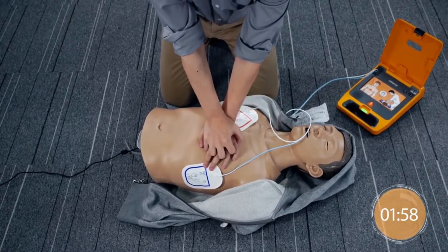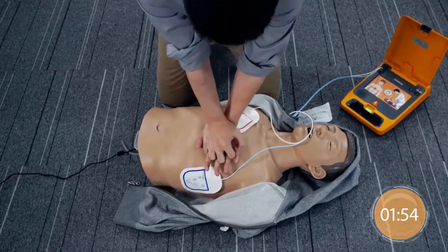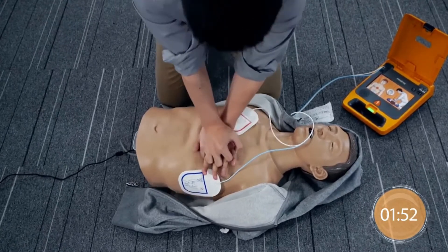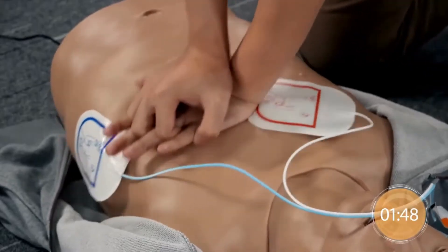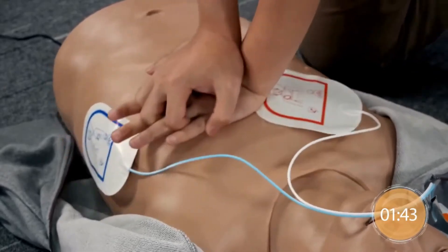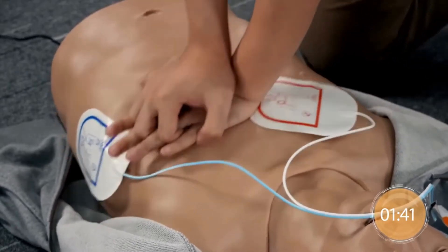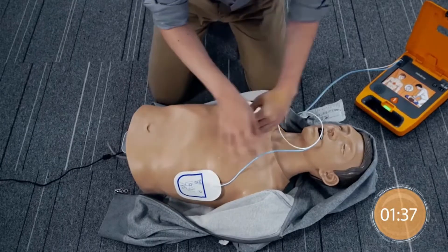Start CPR immediately. Follow the metronome to give 30 compressions and 2 rescue breaths. Give 2 rescue breaths.